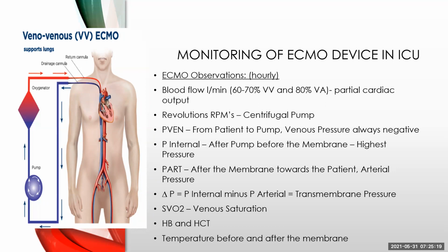So you have to have a clear eye on your membrane, check it with a torch, and see that there is no clotting taking place in there. The only reason that your membrane can clot is because you're not managing your heparin properly. So check your ACTs, see if everyone's doing the ACTs in the right fashion. Are your heparin bags changed every 6 hours?